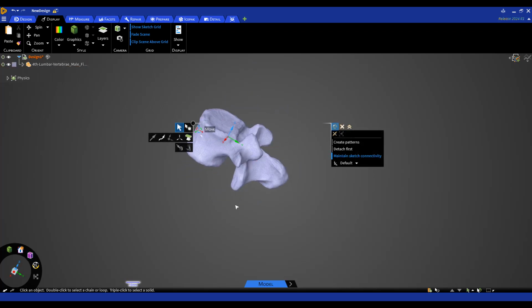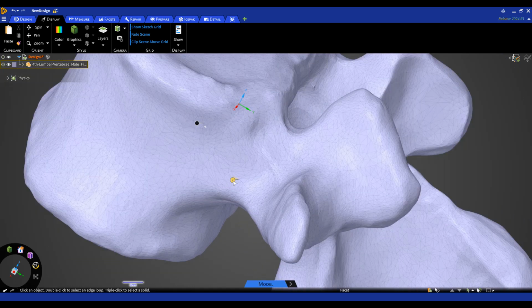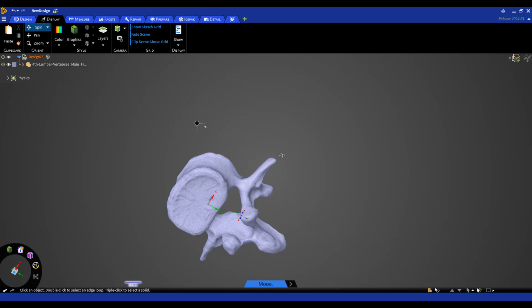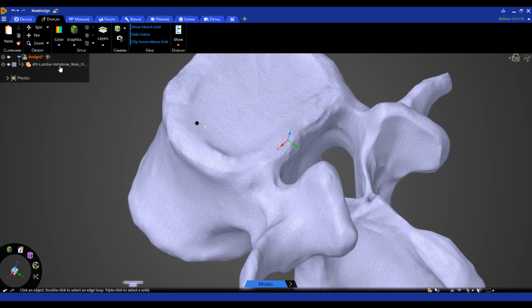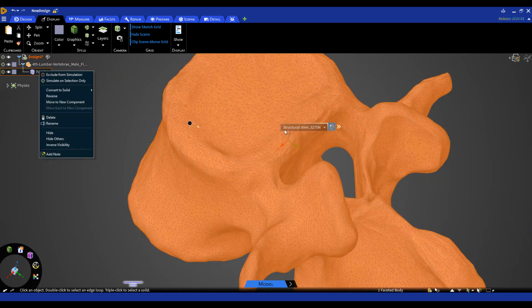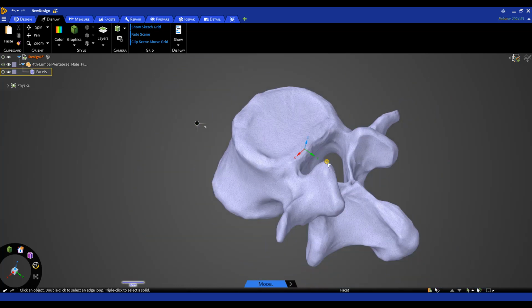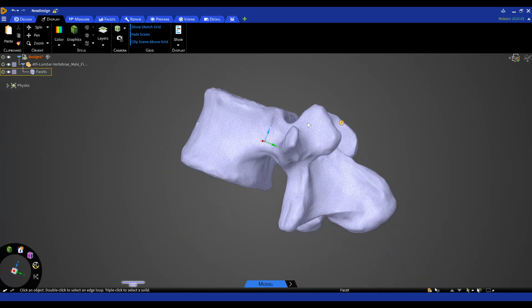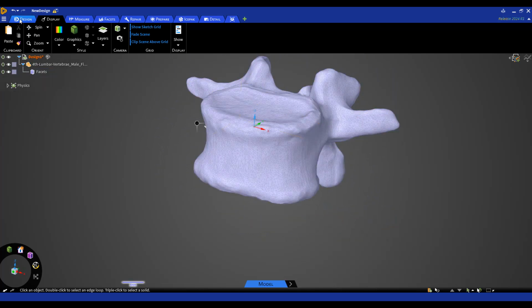There you go. So we have a geometry here, and it's an STL file, so lots of triangles. The capability, historically, to convert this into CAD to solid, there's a few options. I can right-click and convert this into a solid, but it'll be a massive CAD model because there's so many surfaces. I can try to recreate this model, which is very difficult. It'll take a lot of time for me to carefully craft something like this.